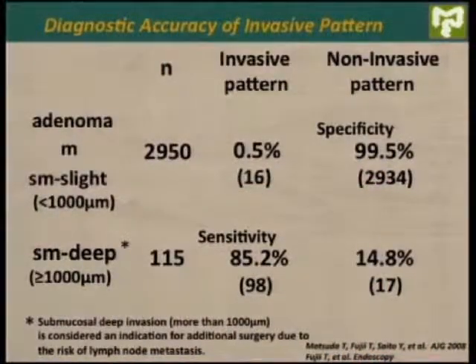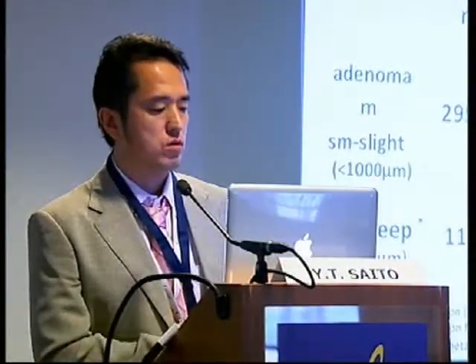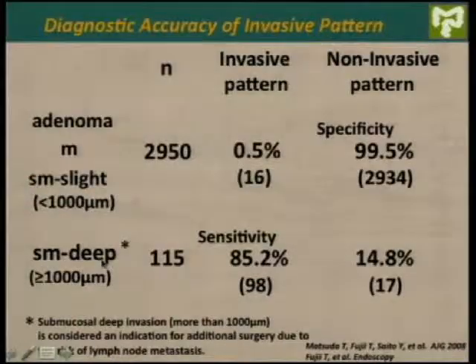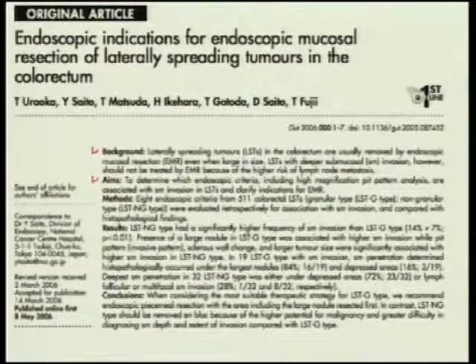And this slide shows the diagnostic accuracy of invasive pattern. As shown, invasive pattern shows high accuracy, including 99.5% specificity and 85.2% sensitivity for differentiating intramucosal or SM superficial region and SM deep invasive cancer. So we are using this invasive pattern in daily practice.